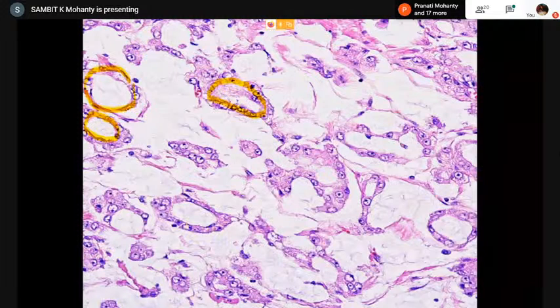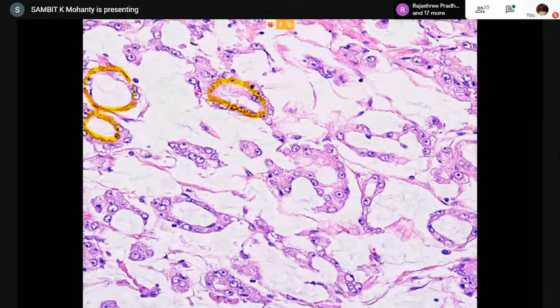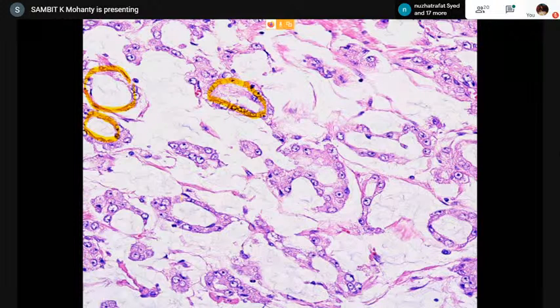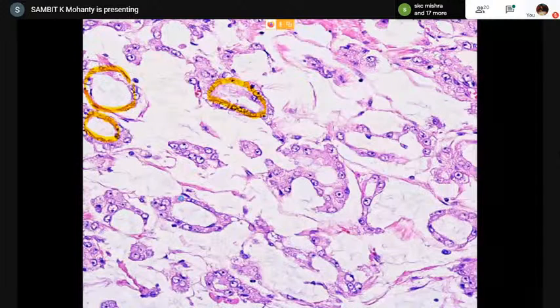And so it's more towards a 5 rather than a 3 or a 4, because these are basically a layer from one gland, a layer from another gland, or strands of cells with mucin all over the place. And in some areas the mucin is in a nodular fashion, or it's making a globule, with glands kind of inside and outside, giving a deceptive look of a gland. So this is possibly 5 or maybe 4, but definitely not 3. Is it clear? These are not true glands. These are pseudo glands formed by the mucin. How about this one?